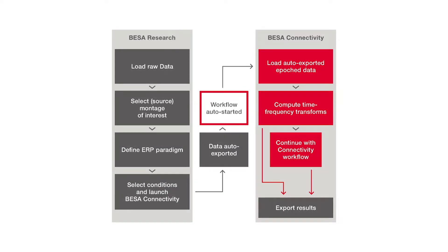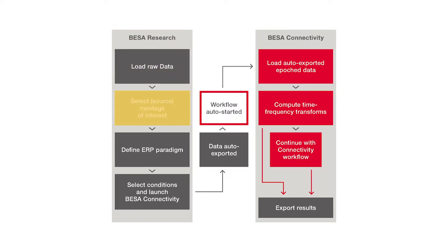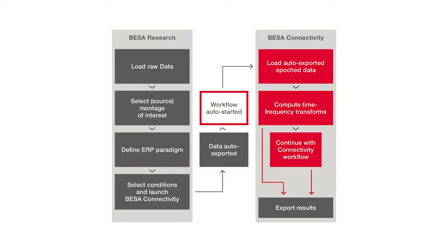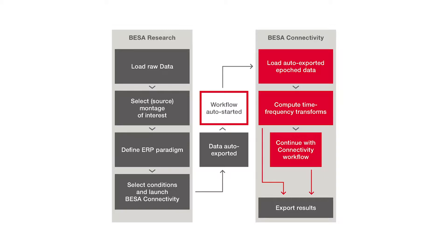In this video I would like to walk you through the steps that you need to take if you want to analyze your data in terms of brain connectivity between the generators of oscillatory activity. This diagram shows the steps that you need to take. After loading your raw data you select the montage or source montage of interest as a first step. You then define your paradigm and define the conditions of interest. When you launch BISA connectivity the data will automatically be exported and the time frequency workflow will automatically be started. After walking through the transformation of the data into the time frequency domain you then start the connectivity workflow, which will crunch the numbers and present you with the connectivity between the montage channels of interest.